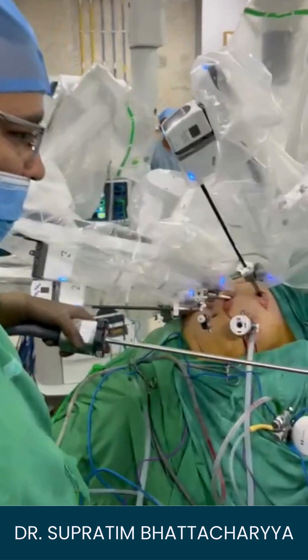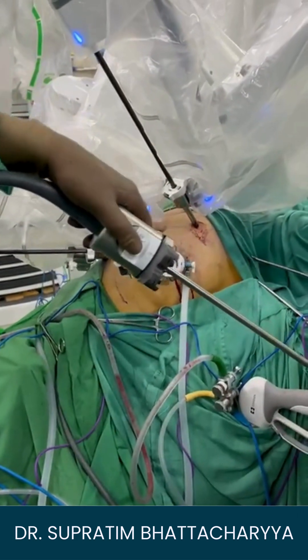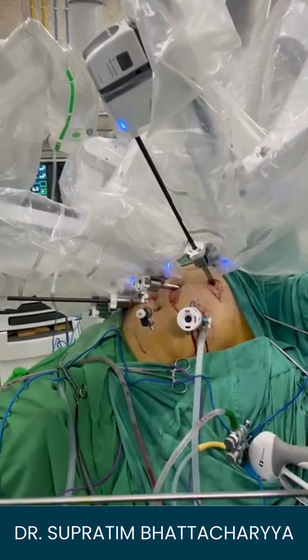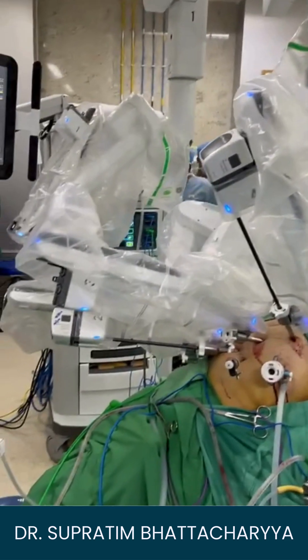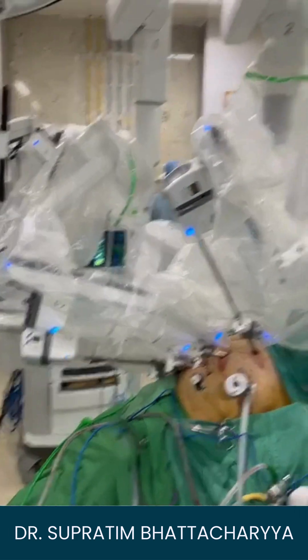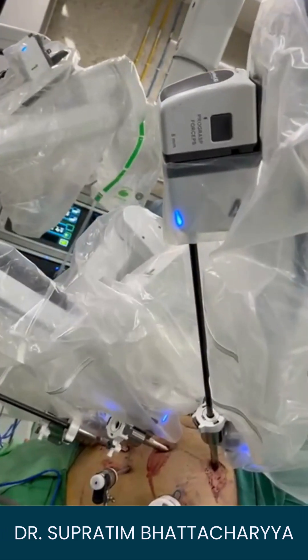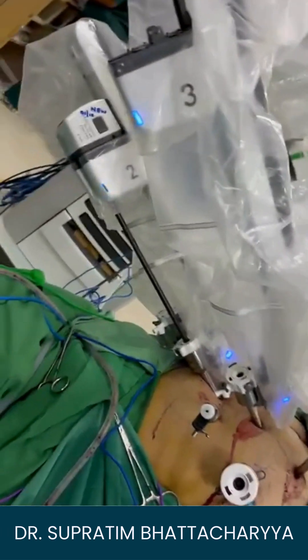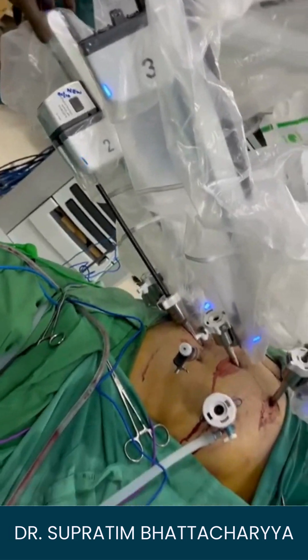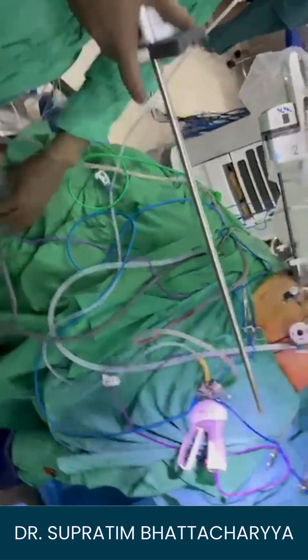As you can appreciate, these are the robotic ports, and the robotic arms are fixed with the robotic ports. These are the robotic instruments — we have a ProGrasp forceps here, we have a fenestrated bipolar. These are all robotic instruments, and these robotic instruments are attached to the robotic arm.